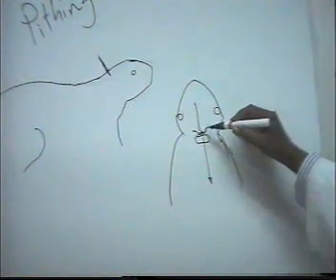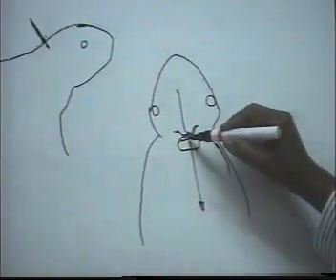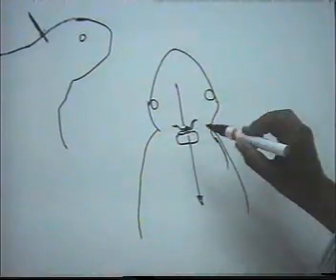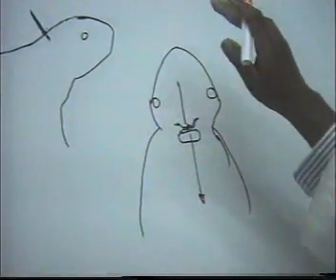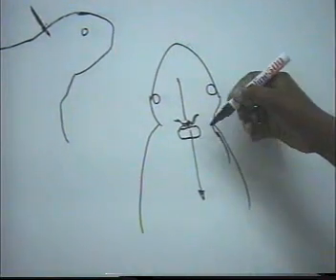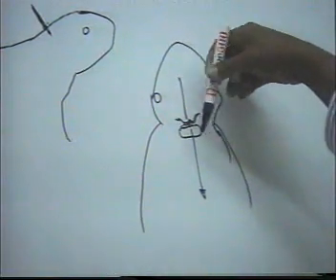We insert the needle at the junction of the skull and the first cervical vertebra, through the foramen magnum forward to destroy the brain, or backwards in the vertebral canal to destroy the medulla oblongata and spinal cord. When the needle is on the right track, the hind limbs of the frog become paralyzed.